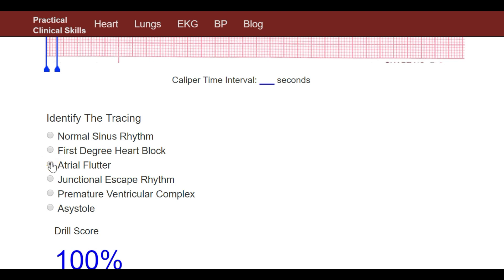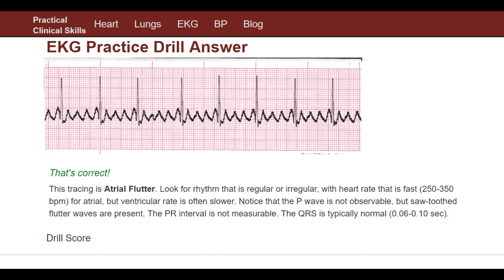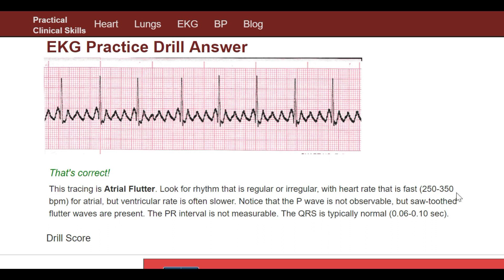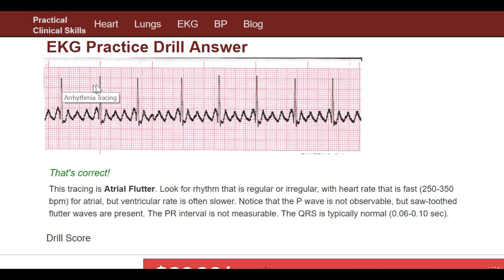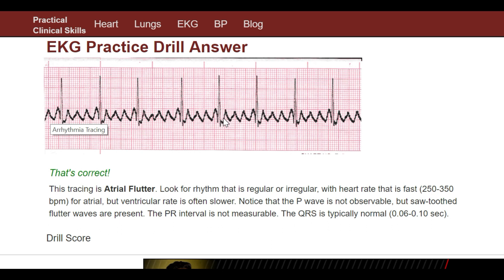That is correct. Look for a rhythm that is regular or irregular with a heart rate that is fast — 250 to 350 beats per minute for the atrial rate — but the ventricular rate is often slower. The ventricular rate involves the QRS, so roughly counting we get about 80 beats per minute, while the atrial rate — counting all of those waves — is obviously faster.